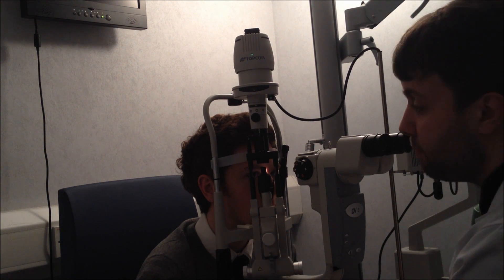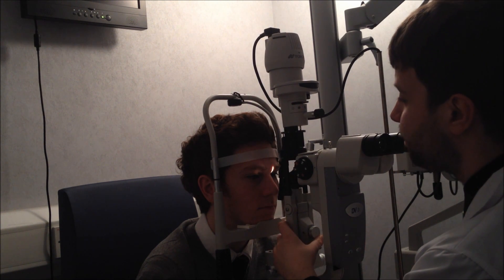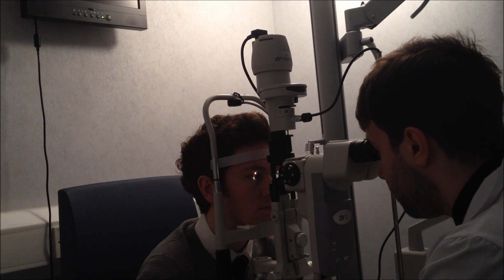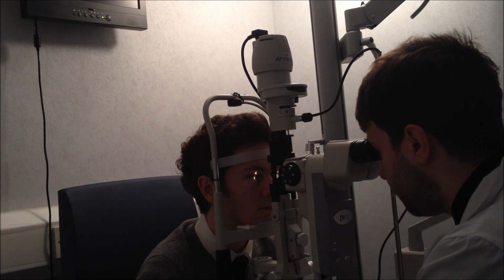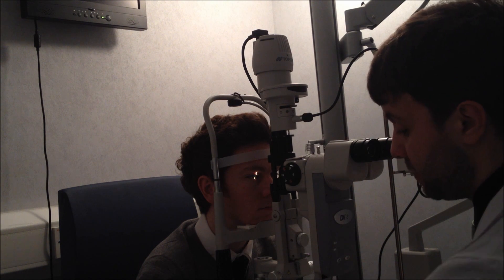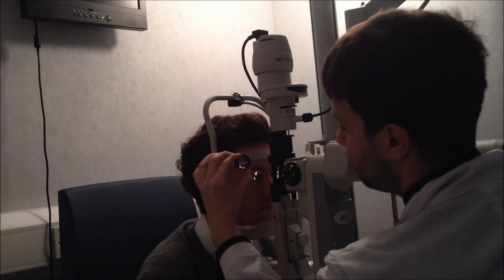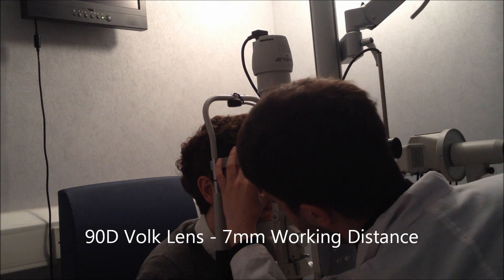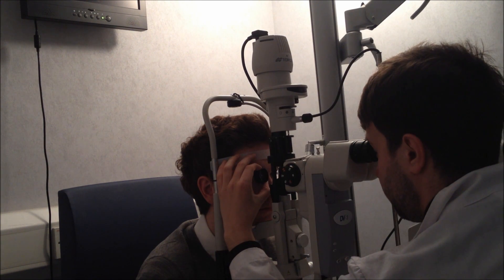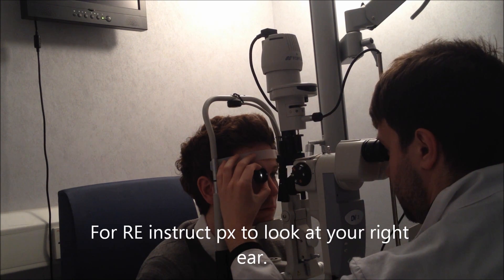The first thing you want to do is set up and make sure that the illumination system and the viewing system are in line with each other. Bring it over the patient's eye, have a look in, make sure it's in focus and just look for the red reflex through the pupil. Make sure that beam is just right in front of the pupil. Then you can use your Volk box for elbow support and bring the Volk up to the appropriate focal length. Look at the side and make sure the light reflex you see is directly over the pupil. Have a look through — you'll be able to see the red reflex — and just slowly start to push back until it comes into focus.